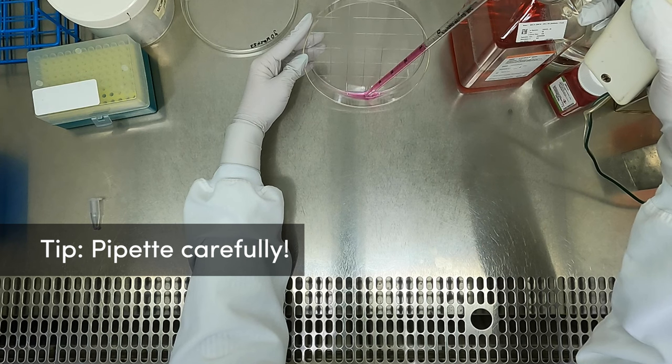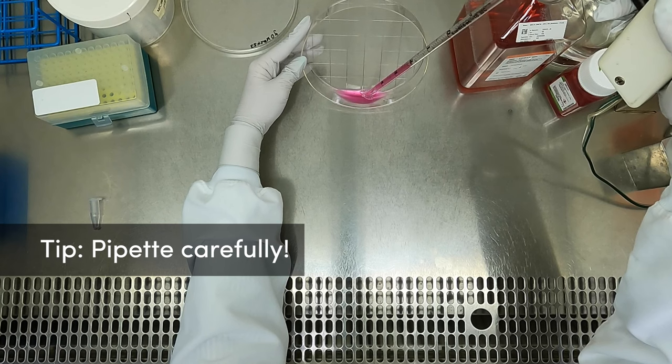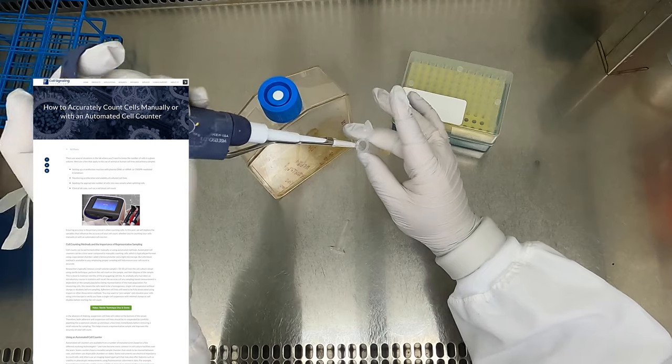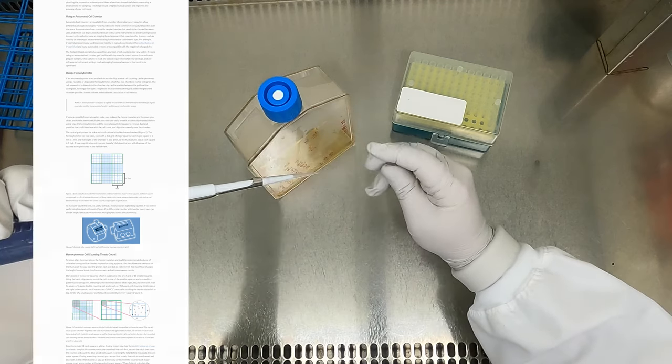As a reminder, pipette carefully at all times, but especially when re-suspending a cell suspension, and avoid drawing liquid into the filter or pipette-aid body. Refer to our blog on counting cells for guidance on counting cells with automated counters or manually with a hemocytometer. We'll leave a link to the blog below this video.